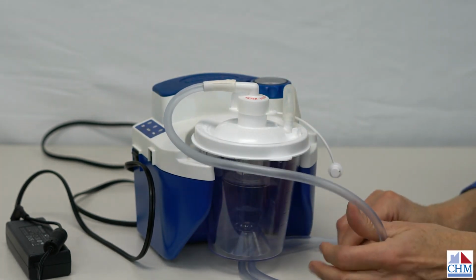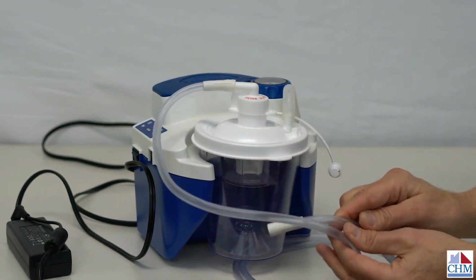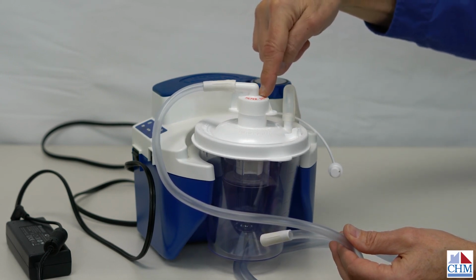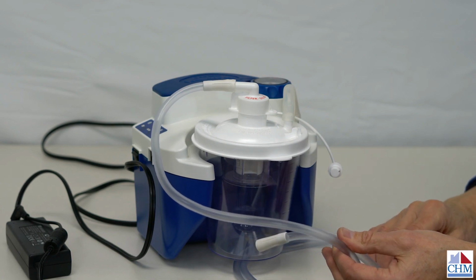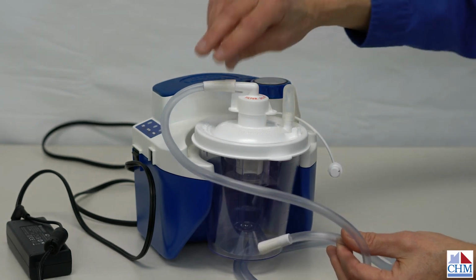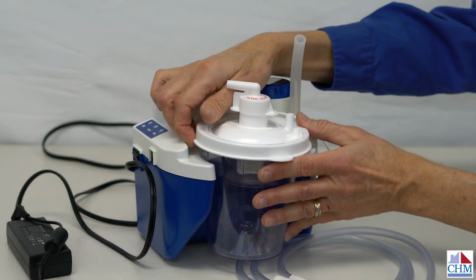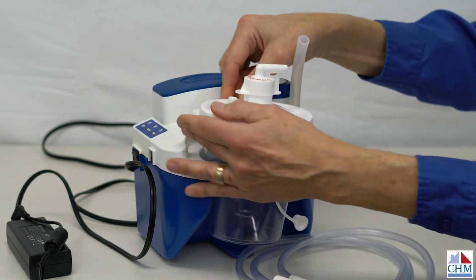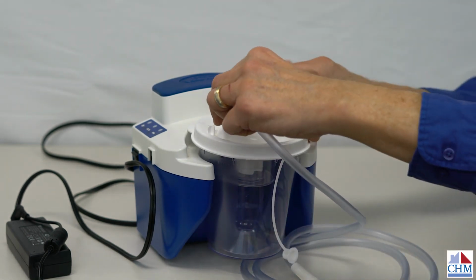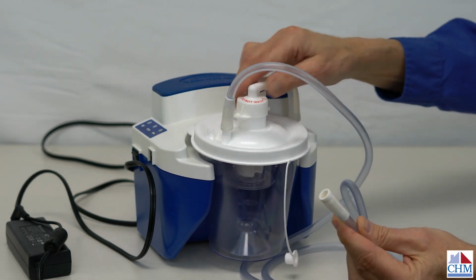So notice now, if the suction machine is hooked up this way, and I draw water into the tubing, it'll go directly into the filter. And in that filter, it'll swell and it'll stop airflow. It'll work for about 10 seconds, and then it'll stop because it just gets occluded with the moisture. So make sure that it's attached properly. So again, let's go back and put the tubing on where it should be. This is attached like so. Put our suction tubing here, and whatever you're using for suctioning here. So this is the proper attachment.